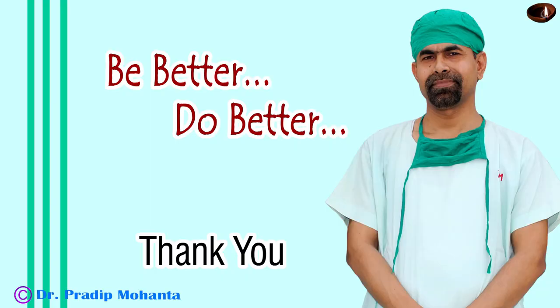Thank you very much for your attention. Hope this video will help you in developing your surgical skills. Submarine chop is not only for hard cataracts — it can be used for cataracts with grade 3 nuclear sclerosis.